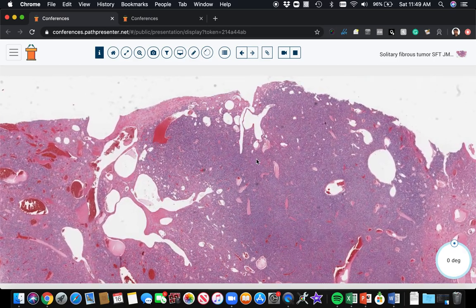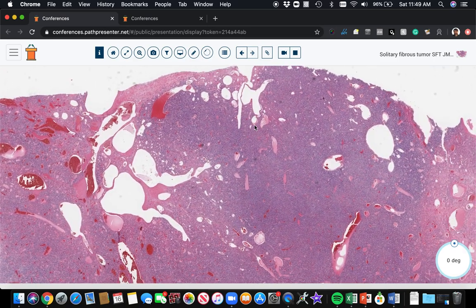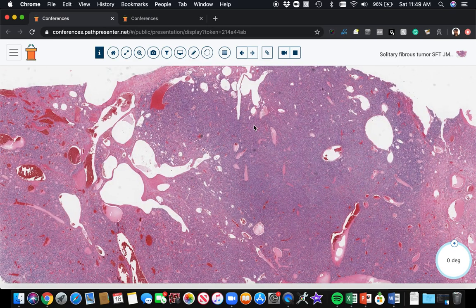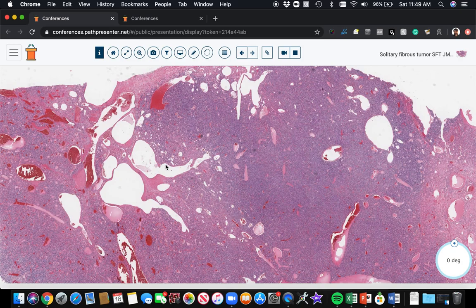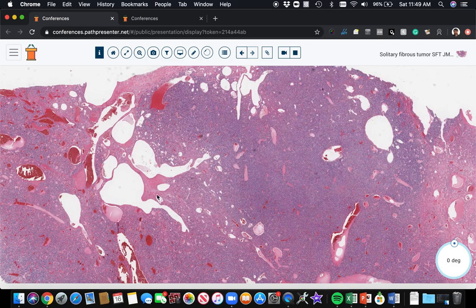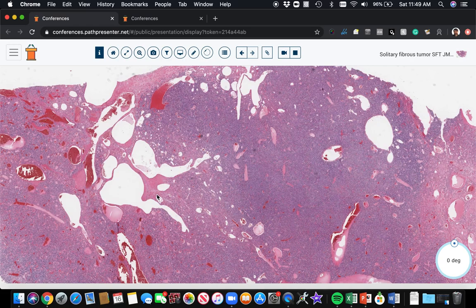This is the characteristic feature that's seen in many solitary fibrous tumors - these dilated, branching, staghorn-shaped vessels. But we can see that vascular pattern in a wide range of other tumors. Synovial sarcomas often have vessels like this. Fibrosarcomas, dermatofibrosarcoma protuberans has vessels like this. Many different tumors can have dilated staghorn vessels.